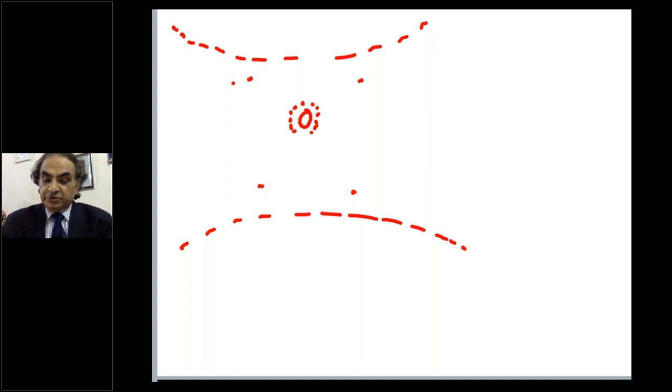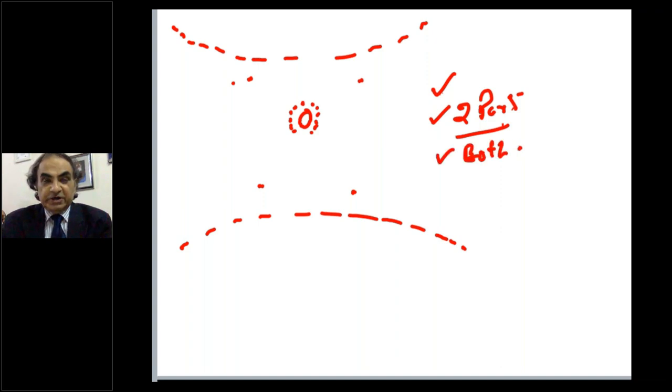At least two ports. And the third important, so first was two ports mandatory, okay? Second is both are held by the surgeon who's doing it. Now it's similar to you playing tennis and the ball disappears in the bush and it's getting dark. So what do you do? You take a torch to search for it. If you're doing that with a torch alone, you may not be able to see it. So what do you do? In the other hand, you take a stick or your racket or something else.